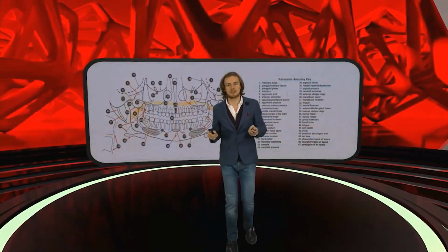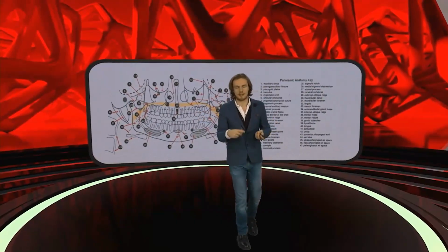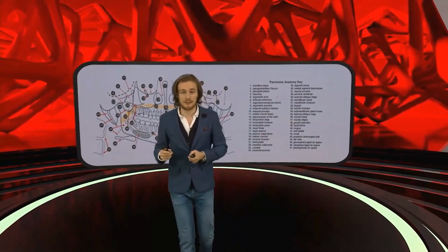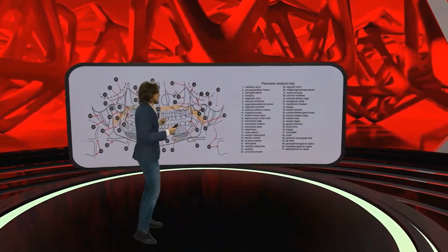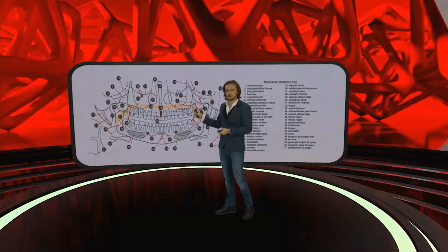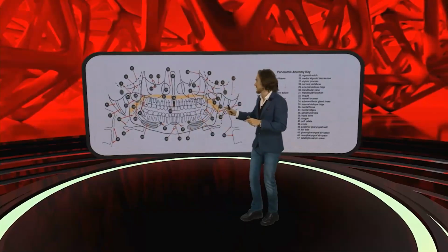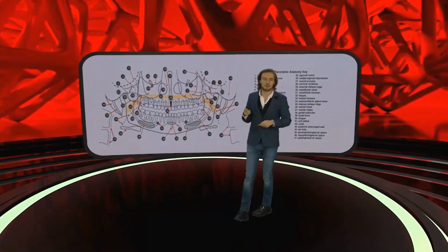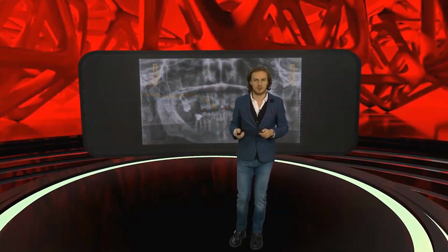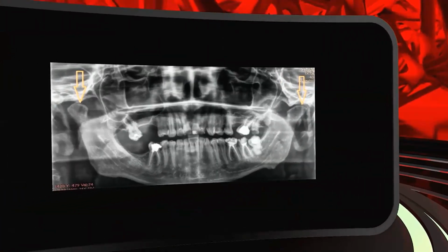And talking about imaging, what is the most common thing when we talk about radiology in dental offices is the panoramic X-ray, right? We could spend a lot of time discussing every single detail, but we will not talk about it so much, because today's webinar is radiology in TMD. So we will mostly focus on the area of the temporomandibular joint. Let's look at what we can see on the panoramic X-ray.